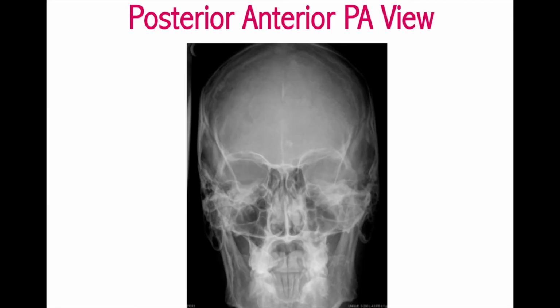Next is the posterior anterior view, also known as the PA view. As the name suggests, it is directed from posterior to the anterior of the face.